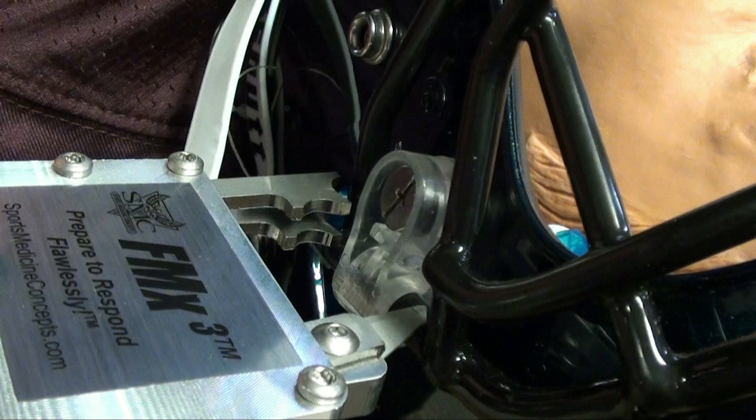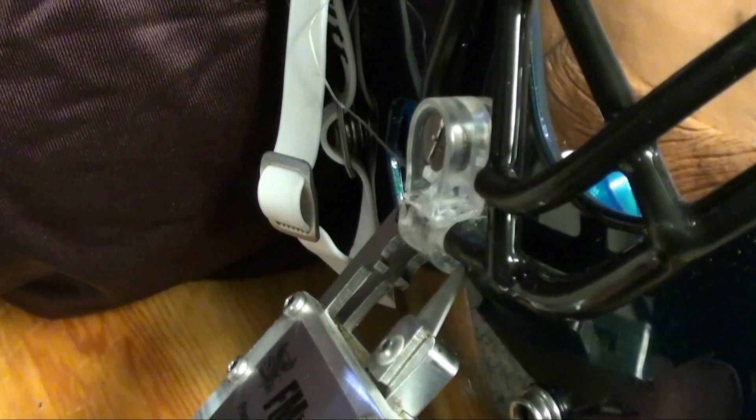In the event that attempts to remove the fasteners using the quarter turn release hardware are unsuccessful, the FM extractor provides multiple options for cutting the lateral fasteners. Although one technique may become a user's preferred technique, all FM extractor users should become familiar with and proficient in all techniques, because factors such as fastener orientation, athlete position, face mask bar style, and environmental conditions may present challenges to use of a particular technique. Becoming proficient in all techniques will provide users with important face mask removal options.